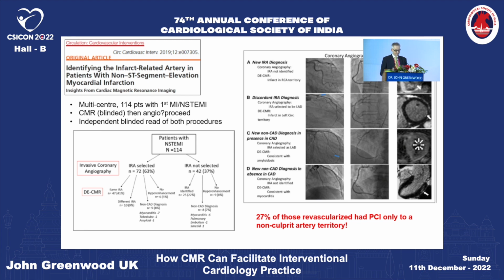And one of the things that's really interesting is that in those where the infarct-related artery was identified at cath, there were actually still quite a lot of them that had a completely different working diagnosis when you looked at the CMR scan, like myocarditis or Takotsubo cardiomyopathy, amyloid.